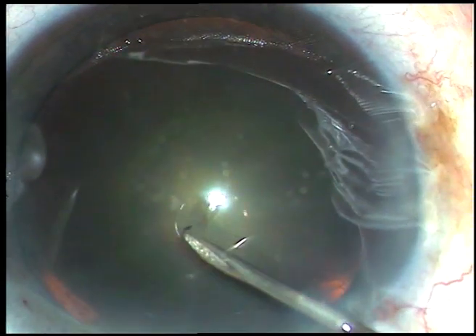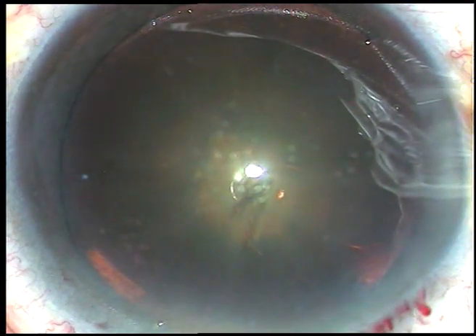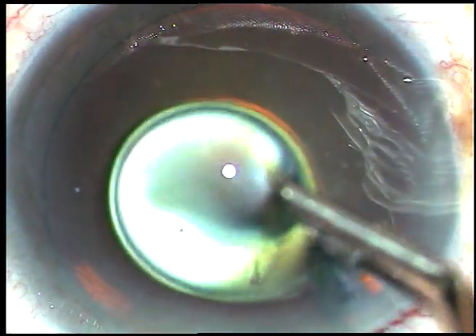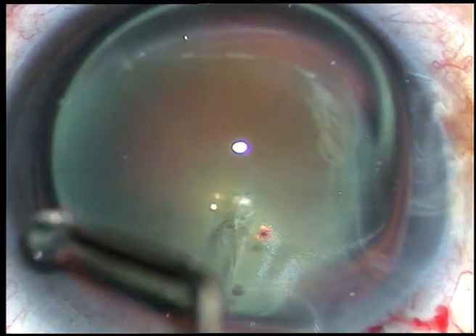The anterior capsule is incised with a 26-gauge bent needle and a capsular tag is raised. Viscoelastic substance is applied over the corneal epithelium for better visibility.